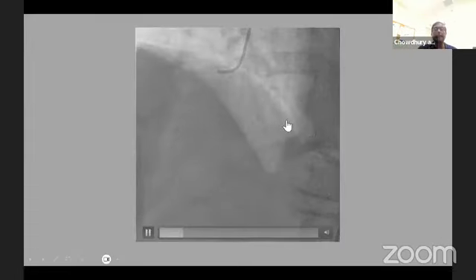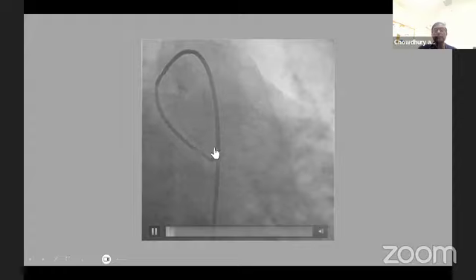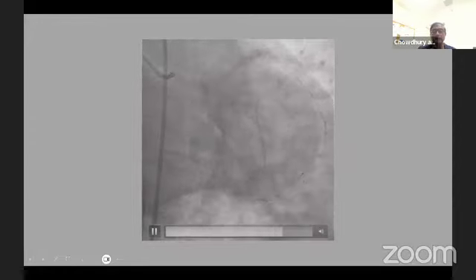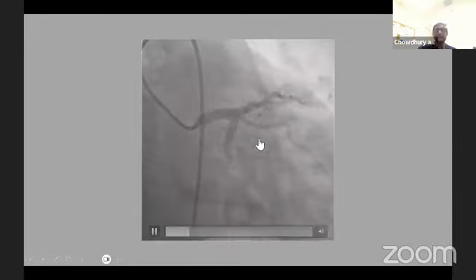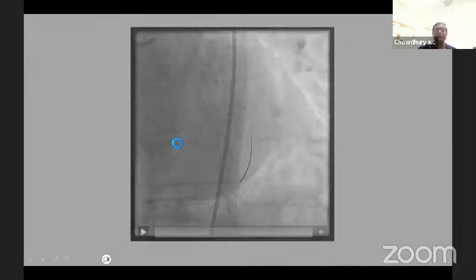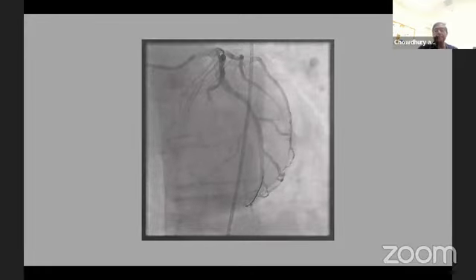Bring the patient to the cath lab within hours. Is RCA good? Where is the problem? Sir, circ. So not knowing the EKG was the problem. So they fixed it, but we lost time. And look at that. It's a very respectable circ.